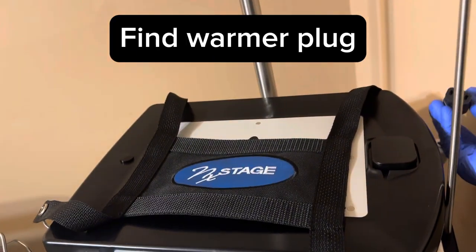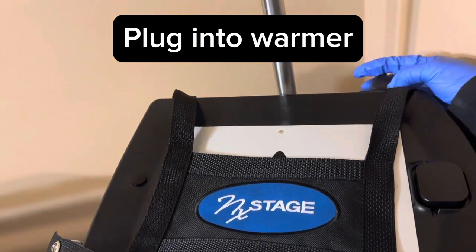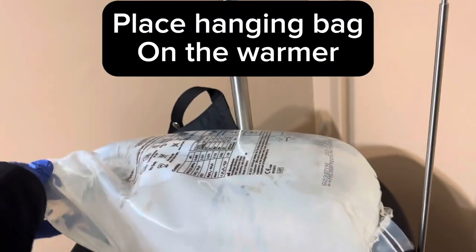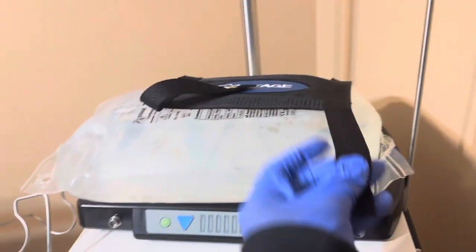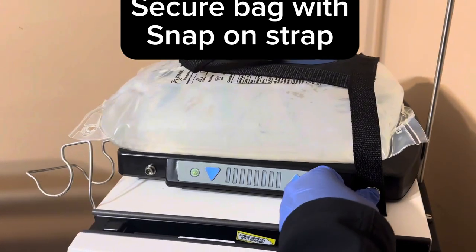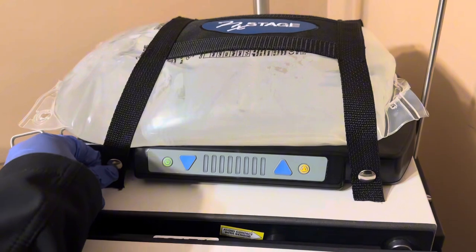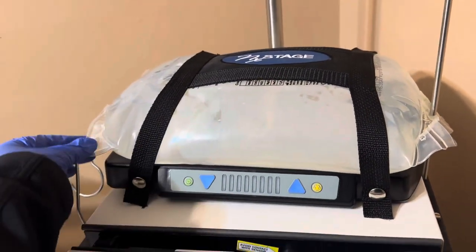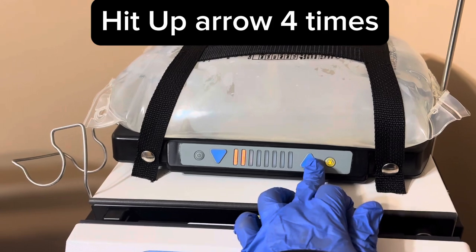Find the warmer plug and plug into the warmer. Place the hanging bag in the warmer and secure the bag with the snap-on strap. Hit the up arrow to set the times.